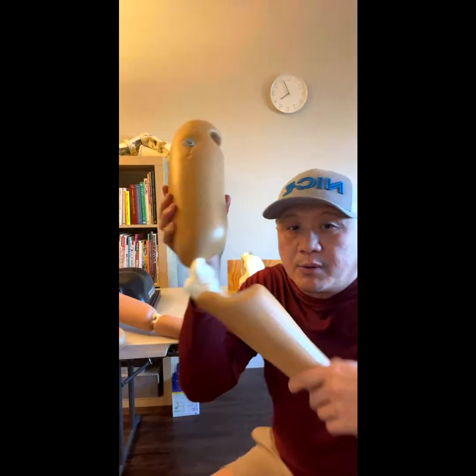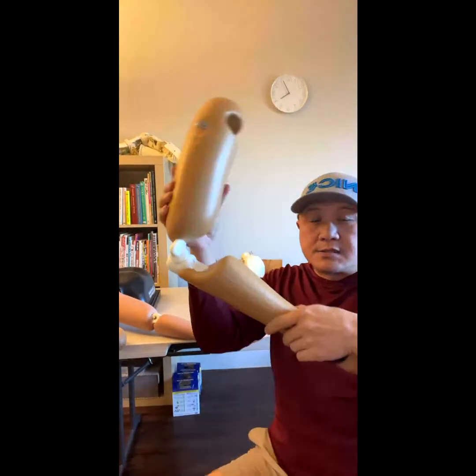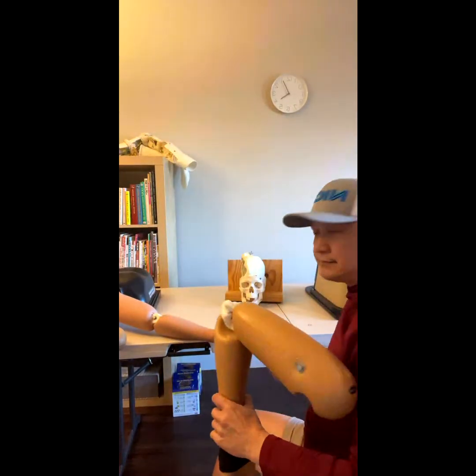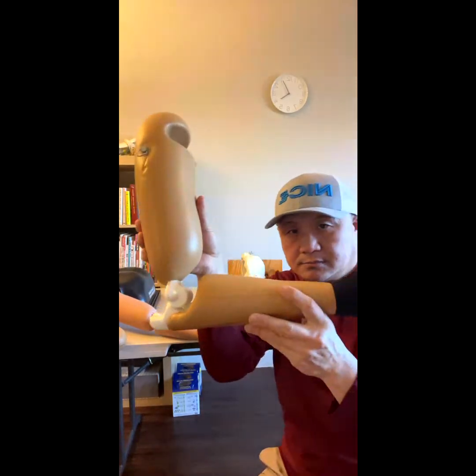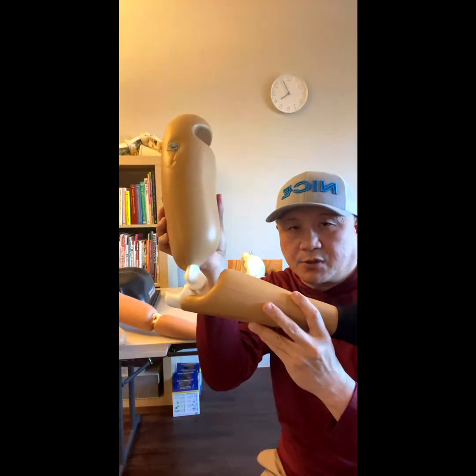This is the elbow model. This is the elbow dislocation model.